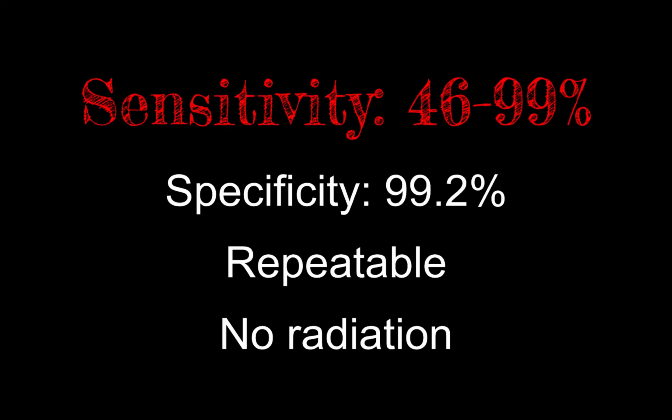For starters, if you do see something on your exam in the correct clinical context, the specificity of these findings is quite high across many studies looking at this, somewhere around 99%. This exam is also repeatable and poses no risk for radiation, which can be particularly useful if your patient has a clinical change in their course during transport.